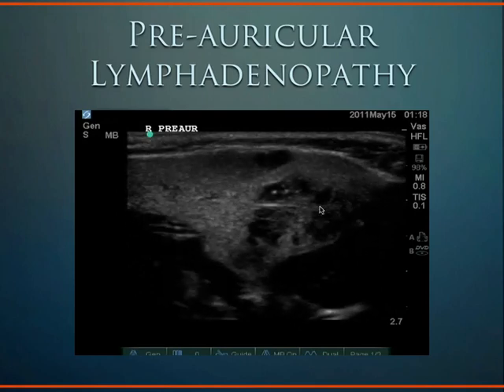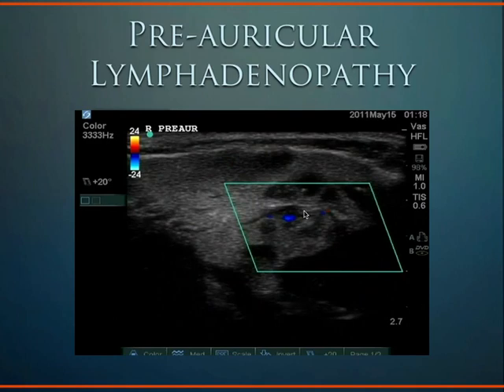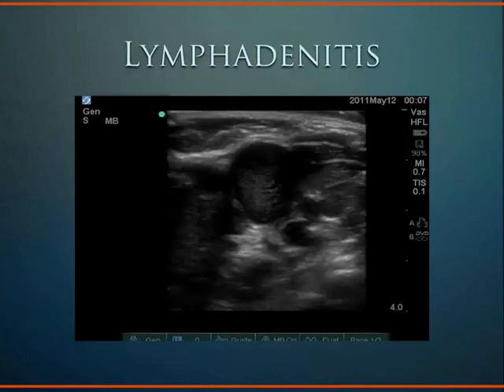These are the lymph nodes. There are about 3 preauricular deep lymph nodes, numbered from 1 to 3, and they lie right in front of the tragus of the ear. Their afferents drain the lateral surface of the auricula and the skin of the adjacent part of the temporal region, and their efferents pass to the superior deep cervical glands.